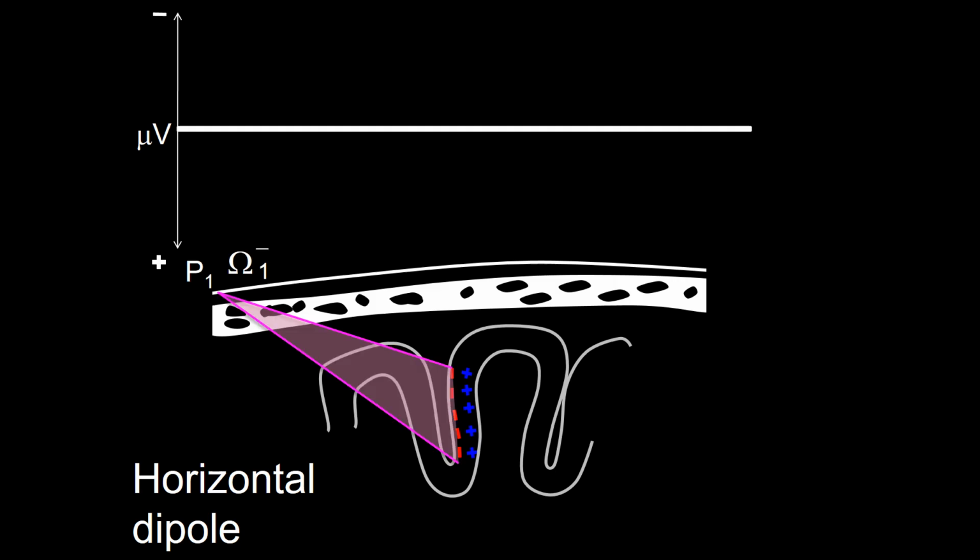On the far left, that is at P1, I have represented the position of the leftmost electrode and the omega symbol to indicate the solid angle it has. In this case, the angle is negative. Translating this information to the voltage line, we have to plot it at some level in the negative portion of the line. I have plotted it just above the neutral line in the voltage line, as you can see.